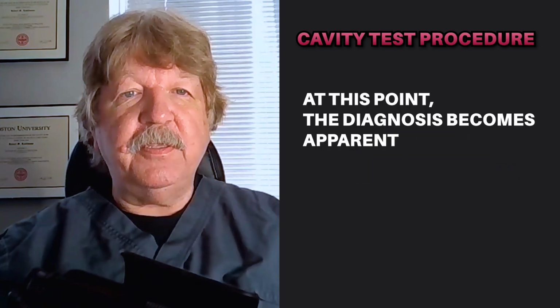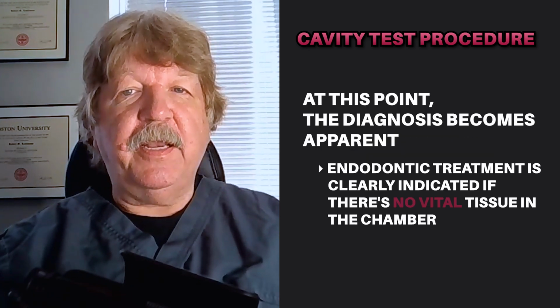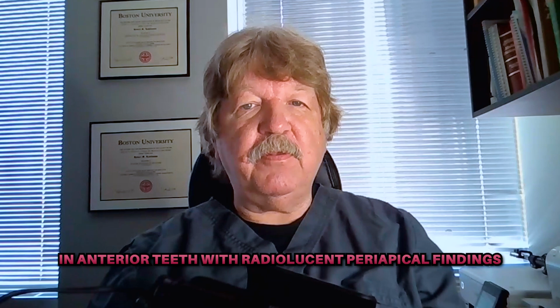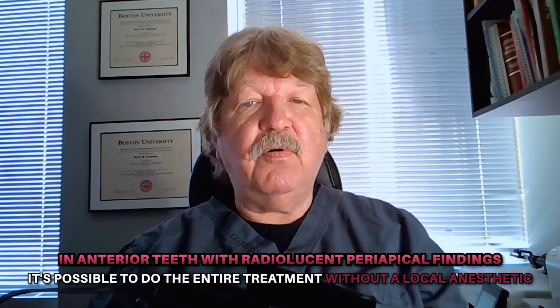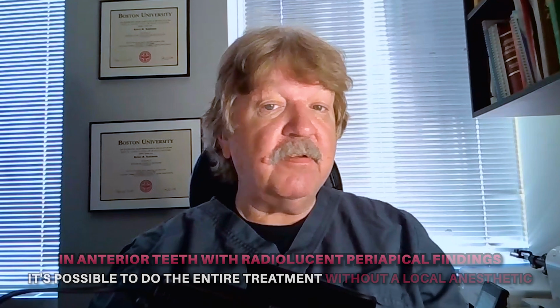At that point, the diagnosis becomes apparent, and endodontic treatment is clearly indicated if there's no vital tissue in the chamber. In anterior teeth with radiolucent periapical findings, it's possible to do the entire treatment without a local anesthetic. And I do this very frequently. Patients are amazed. I do a lot of these cases in this manner, and patients are astonished that they can be treated without a local anesthetic.